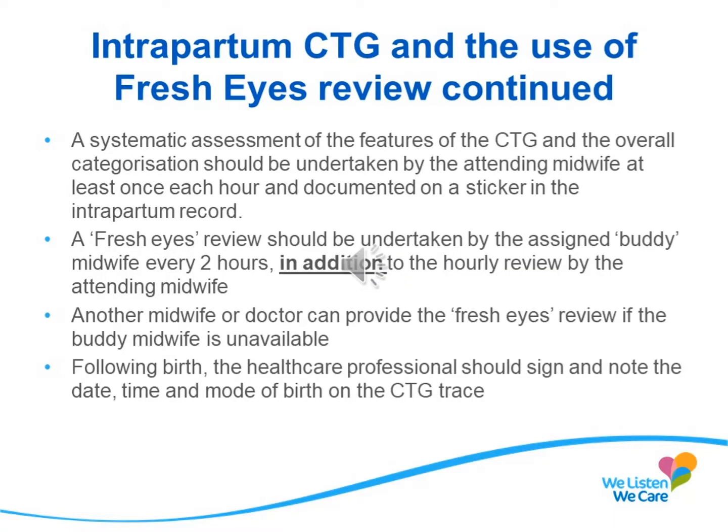The attending midwife should perform a systematic assessment of the features of the CTG and the overall categorisation at least once each hour, and this should be documented by using a sticker in the intrapartum record. Additionally, a fresh eyes review should be undertaken every 2 hours. This should usually be performed by the named buddy midwife. However, if the buddy is unavailable, another midwife or doctor can provide the fresh eyes review.